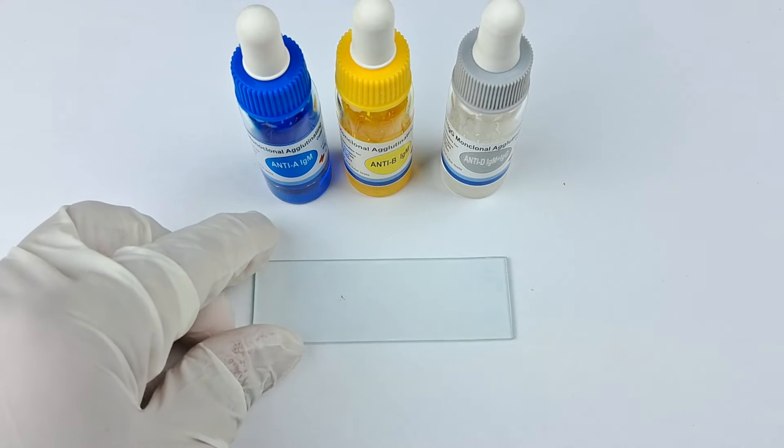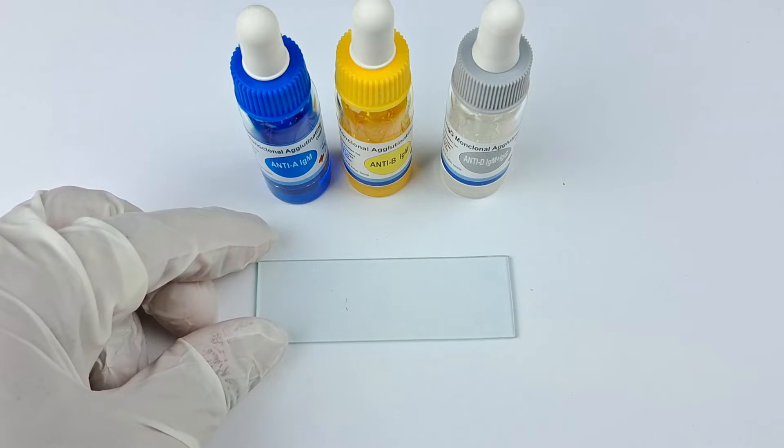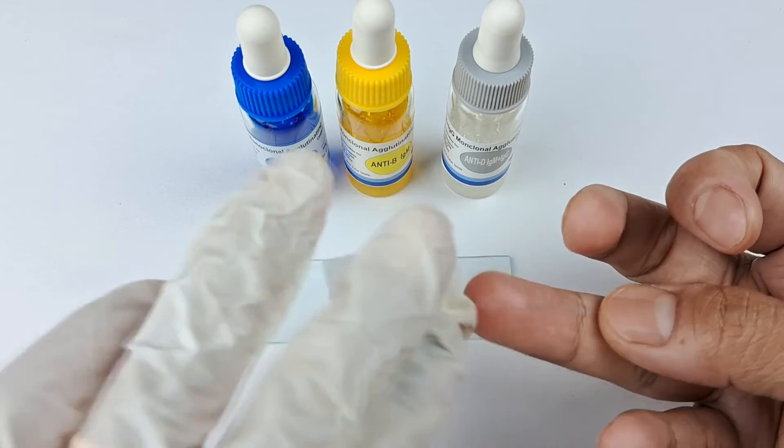Meanwhile, take the pre-cleaned glass slide and place it on a white sheet of paper or porcelain tile. Next, surface sterilize the tip of the middle or ring finger using an alcohol swab.